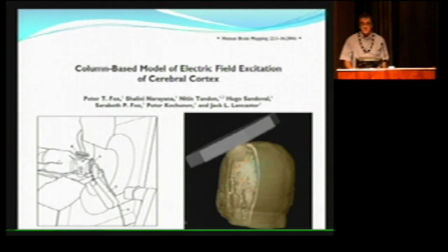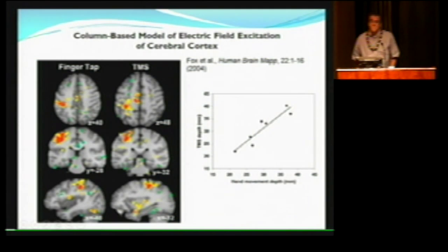And the precision of that was such that we considered armatures and we measured their sag and found that these suck, that there is just no earthly way. So we kicked out a bunch of money to get an FDA-approved neurosurgical robot and got an agreement from the company that we could reprogram their robot to do what we wanted. So we got a developer's agreement to reprogram their robot and built a completely robotic system that was also MRI compatible. This is for the sham, which makes a clicking at the same decibel level relative to the ear as this. And so this was the experimental setup that we used to acquire these data.